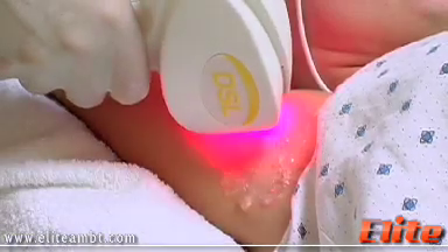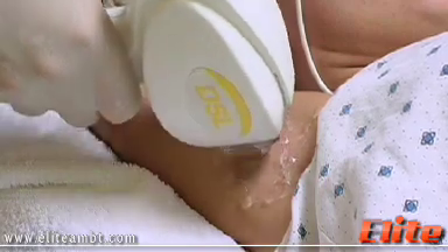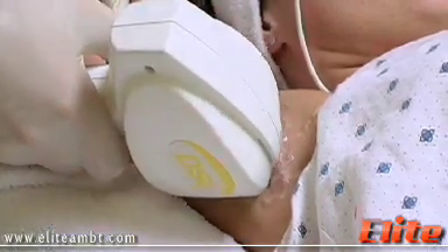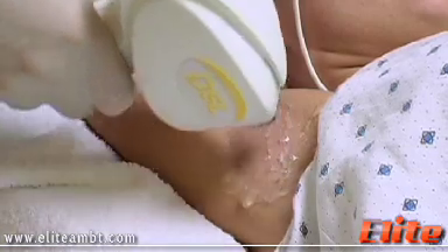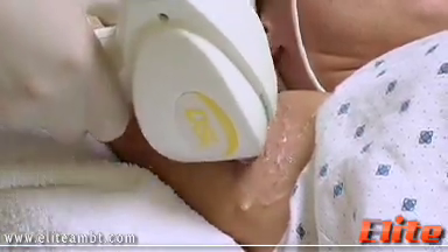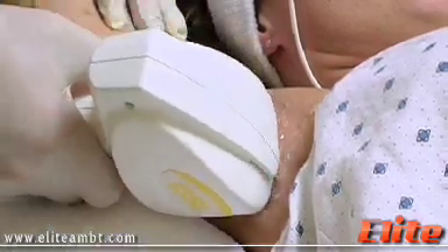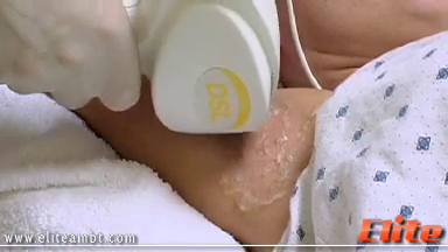There might be some redness after the treatment, which usually disappears in a matter of a few hours, and there are really no long-term side effects with this type of treatment. Because of the ELOS technology we can lower our optical fluence, our optical energy, to avoid any downtime or any possible side effects.